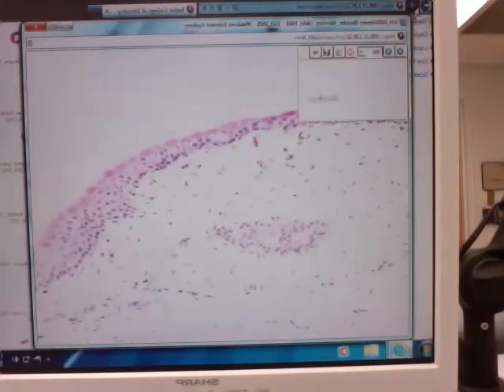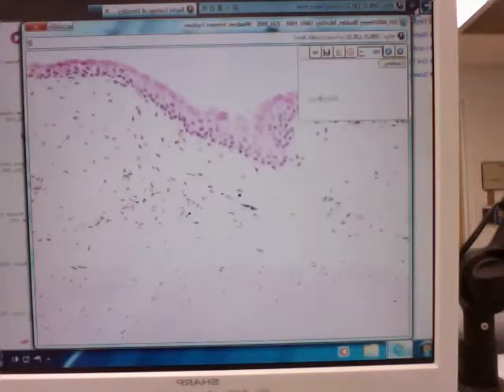Scattered amongst areas, like if you focused in, like on here, okay, you see other areas and some other organs we'll do later where you can very obviously see dense irregular. Here it's all shredded up pretty much, but all this connective tissue in here is dense irregular connective tissue. Lots and lots of fibers, very few cells. The only cells that would be present would be examples of fibroblasts. Okay? This other stuff is muscle, not anything we've had so far.